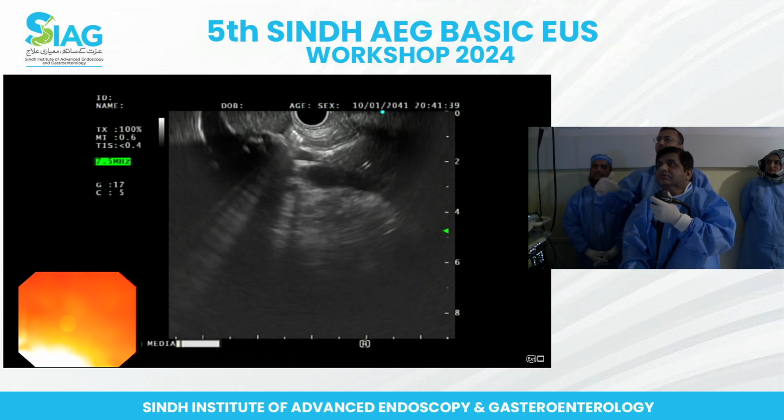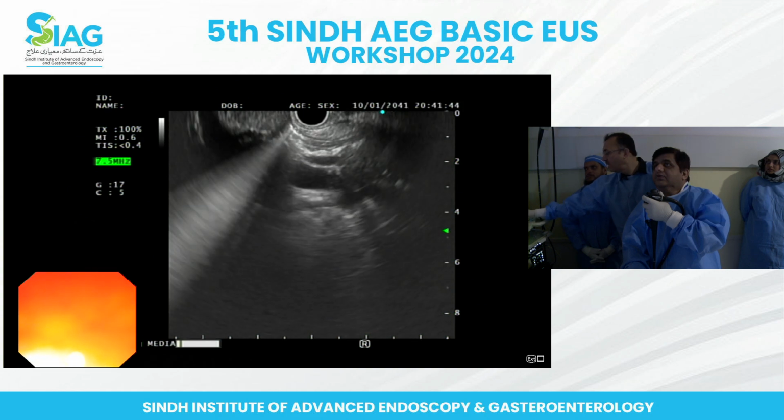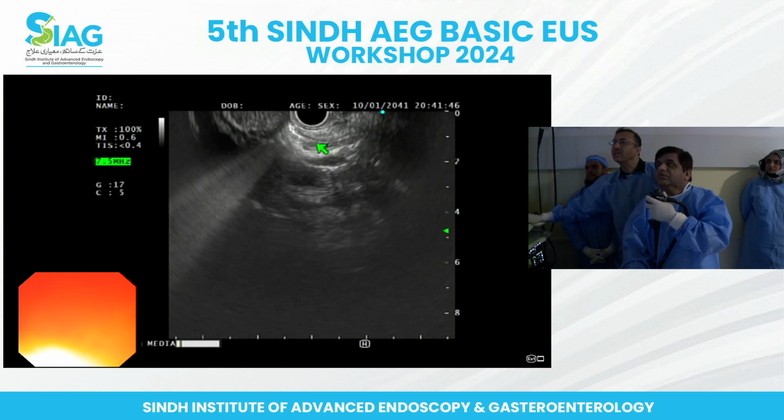Maybe calculus, maybe stent which is giving you the shadow, but important thing is that this is the area that you are interested in.